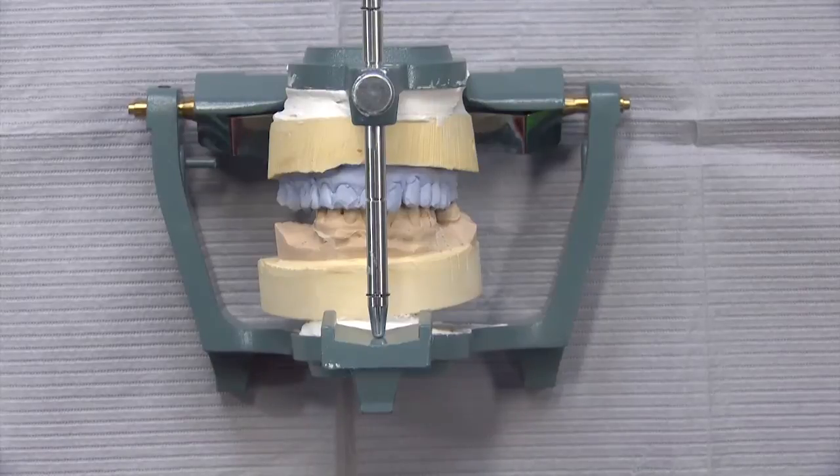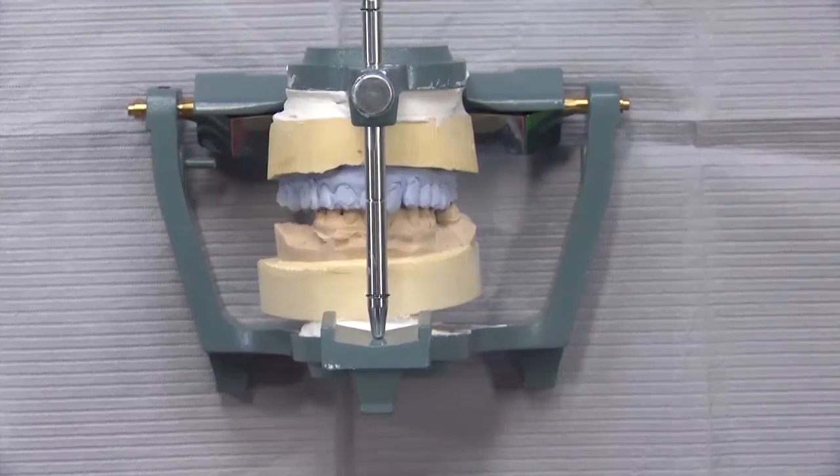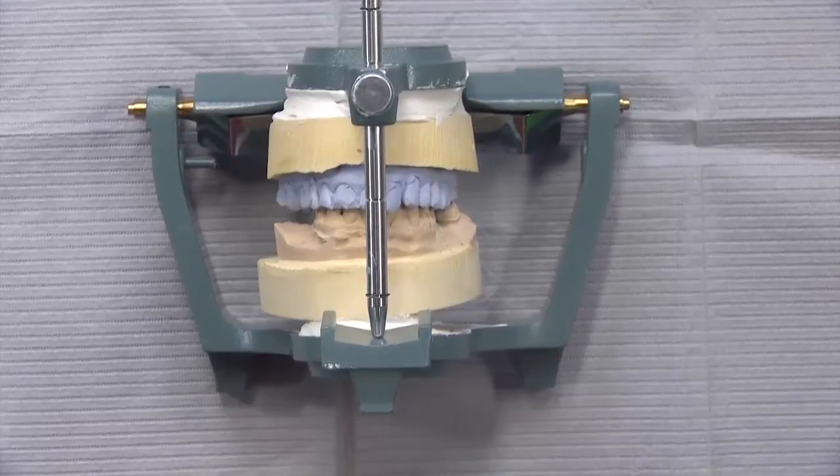My biggest issue with the technique is that it's really centered around not wanting to pack cord. And so we come up with this technique, a 2-step technique to drive the wash material subgingival so that we don't have to pack cord. But it carries some liabilities with it. As a result, we have restorations sometimes that don't fit and complicate things in the lab, all in the name of not packing cord, and there's got to be a better way.